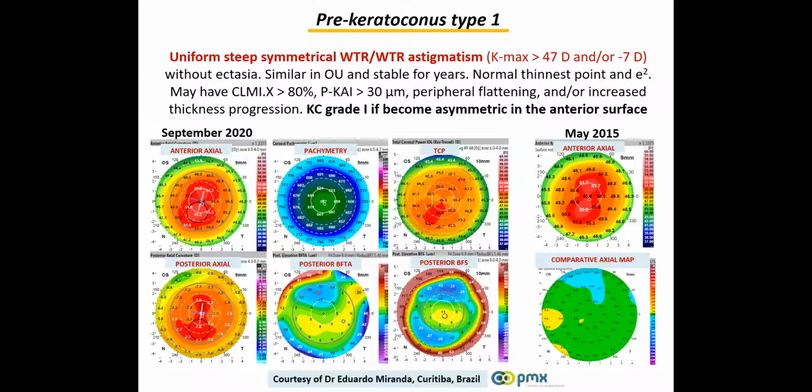So I put rings in two segments, and the cornea with this kind of pattern began with 6 diopters of cylinder, and now has only 0.5 diopter of cylinder. So the patient is very happy because now she can use glasses with the right correction in both eyes. And I have observed that girl since she was 6 years old, now she is almost 25 years old.